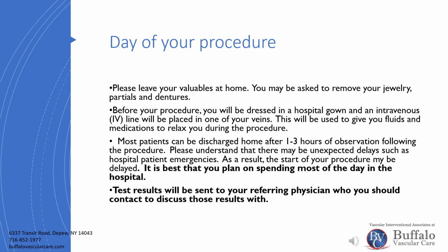Please understand that there may be unexpected delays such as hospital patient emergencies. As a result, the start of your procedure may be delayed. It is best that you plan on spending most of the day in the hospital. Test results will be sent to the referring physician. You should contact them to review these results.